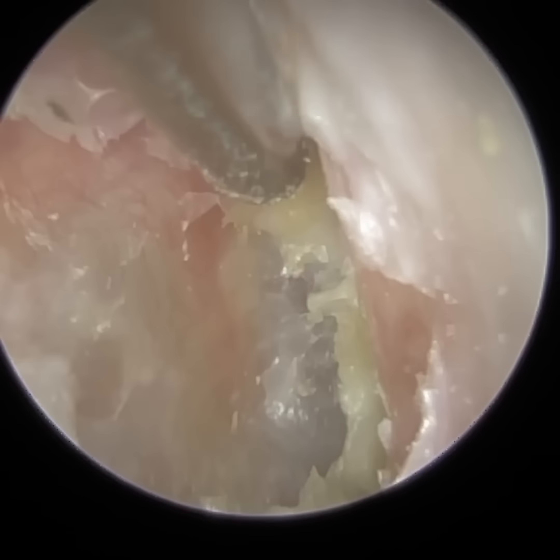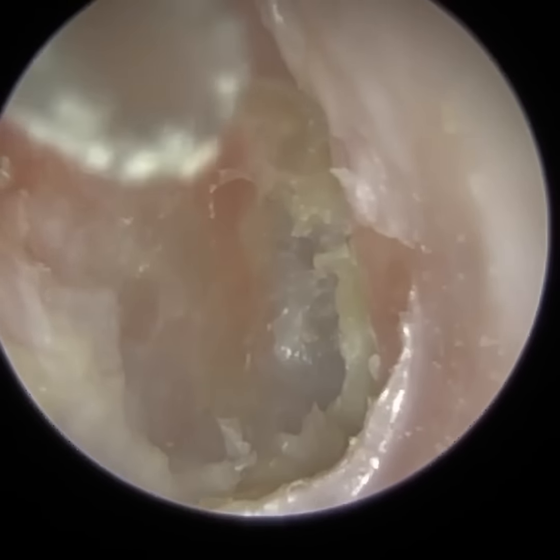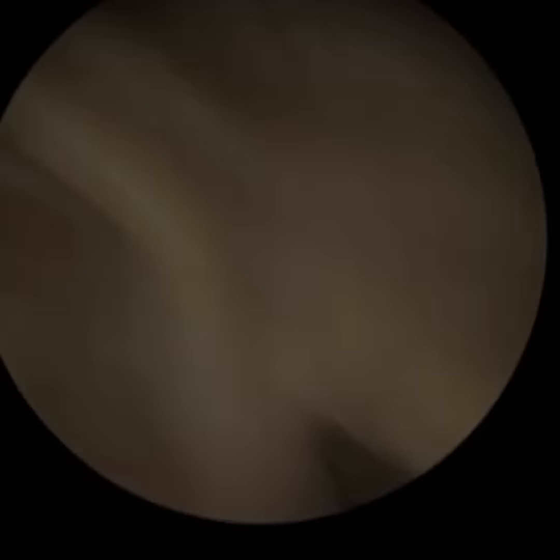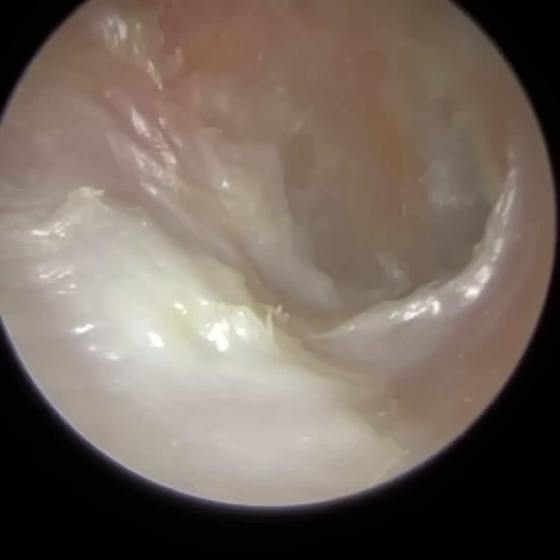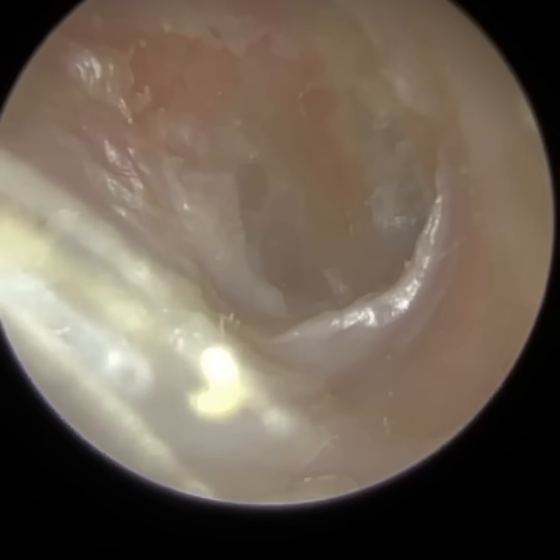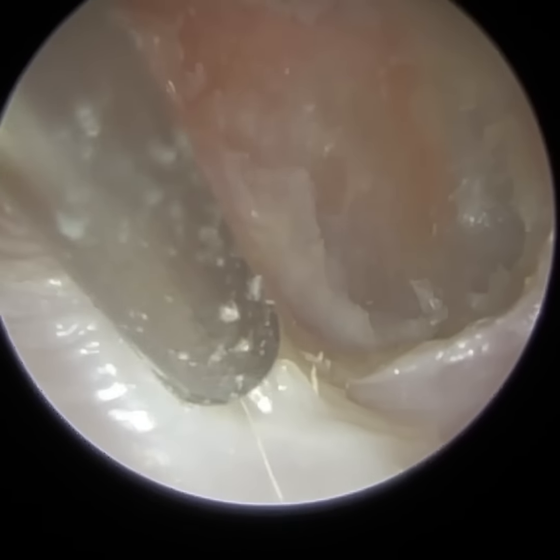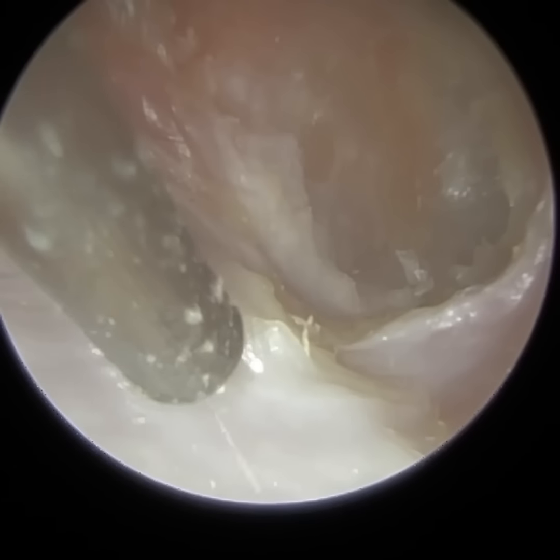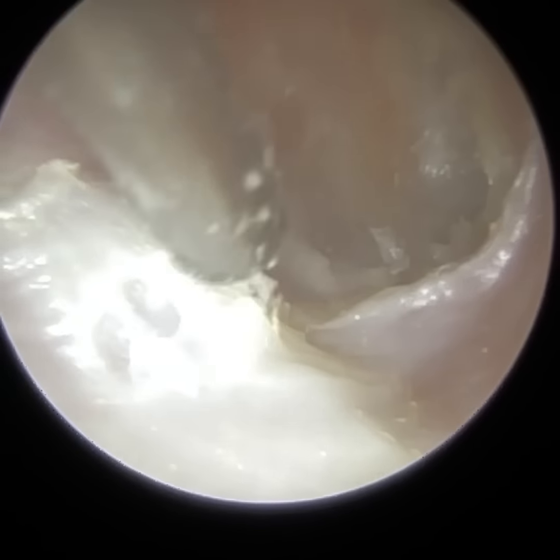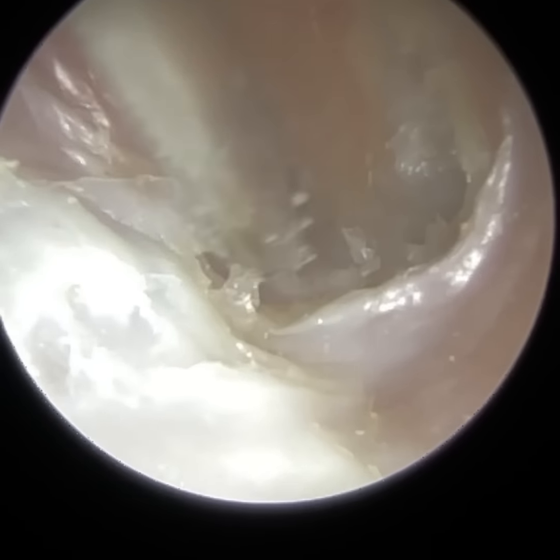Connor's really taken to them. He really prefers them to the normal ones when I spoke to him yesterday. I think we've both learnt quite a few things. I've learnt a bit more about photography from him, and he's learnt about the wax scope and these new suction tips that I'm using. The 17 gauge compared to the 18 gauge is still very narrow and thin, but they're less likely to get blocked and have a bit more suction power, so I really do prefer that.